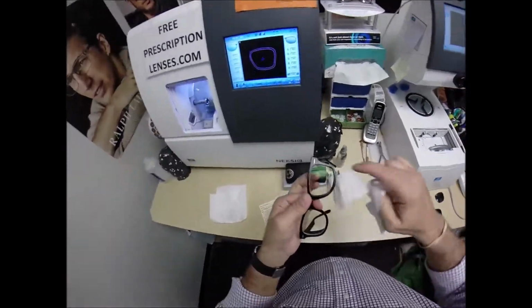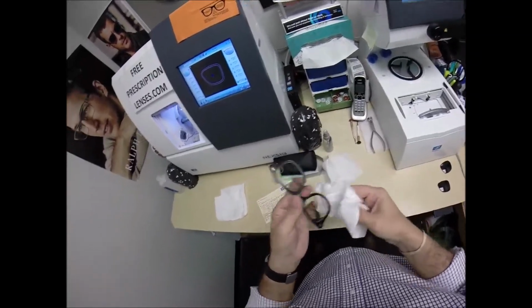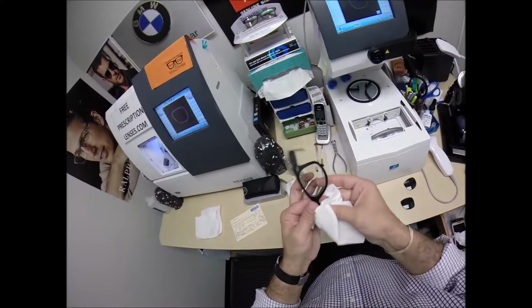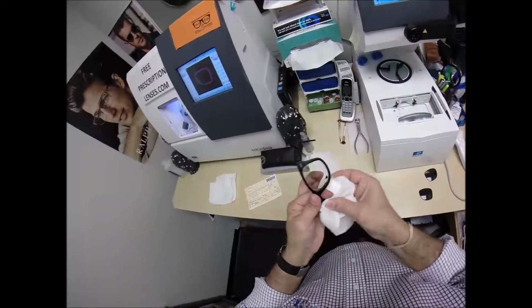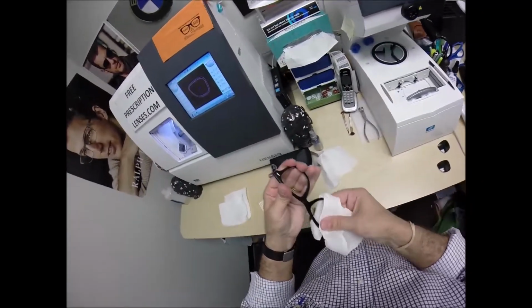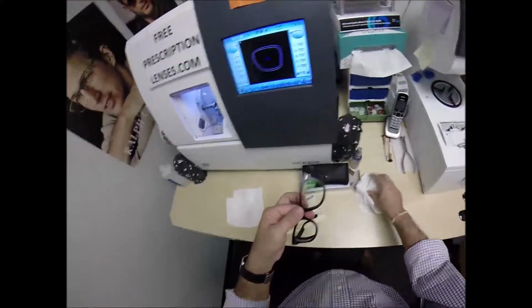The Crizal anti-glare coating comes with a little powder coating, and I'm trying to get it all around the edge of the lens. I don't use the harsher chemical near the lens. I do it in the center to take off the ink from the lensometer. Then I use a generic lens cleaner to clean all the way up against the frame, just to protect the finish of the frame. I don't like any harmful chemicals to be near that.